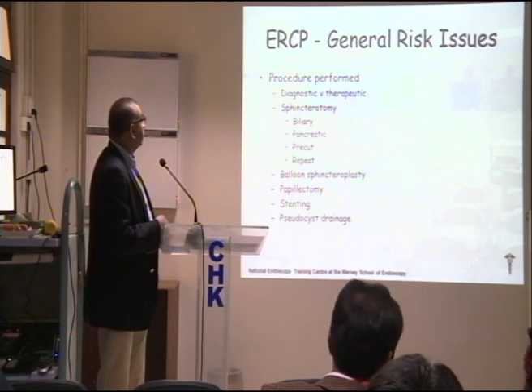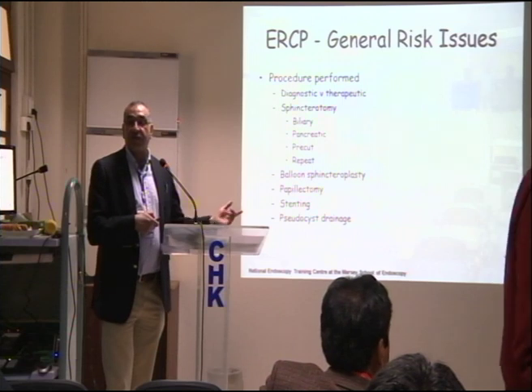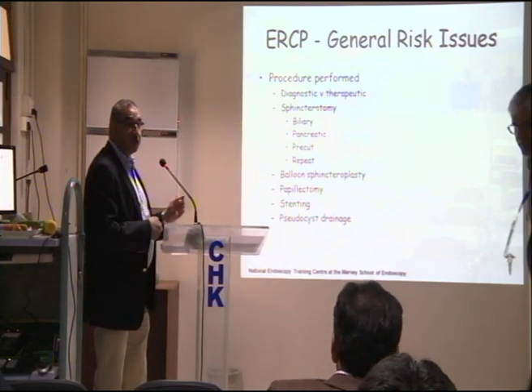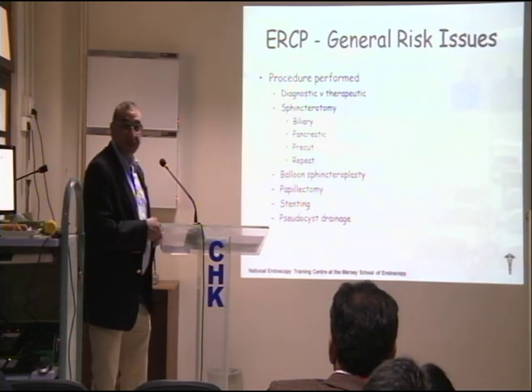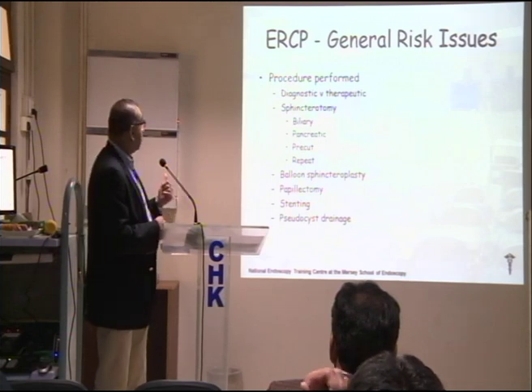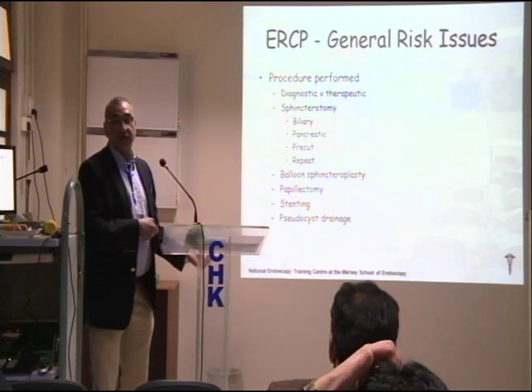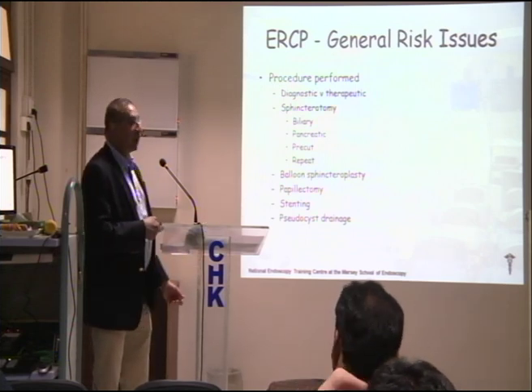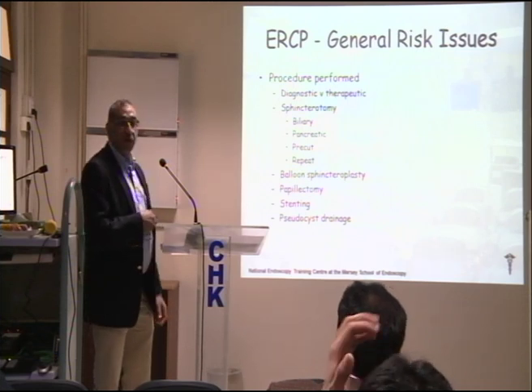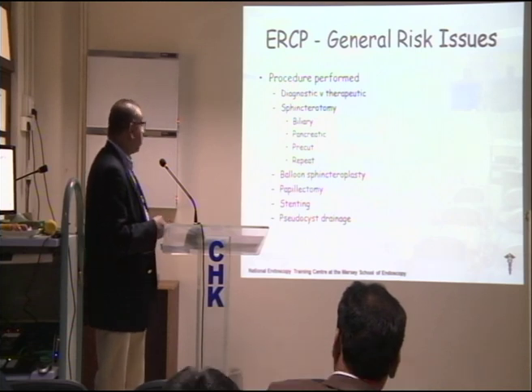Again, I would stress that ERCP is not something that you do as a diagnostic procedure, because even if you don't carry out any therapeutic procedure, ERCP still carries the risk of pancreatitis in a diagnostic procedure, and even perforation if you are not careful. And I've seen people perforate, and it's very difficult to justify a complication when the procedure was not indicated. So always think about how it's performed.